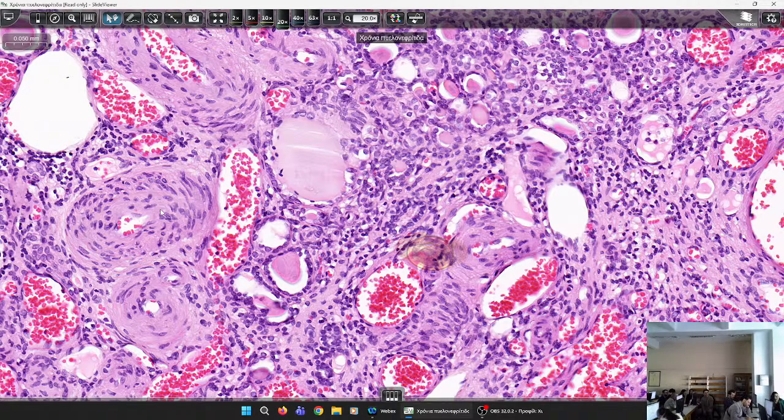And what is the consequence of this? What can this justify? It can justify the atrophy of the urinary tubules. Why? Because the urinary tubules expect what will come out of the glomerulus, the efferent arteriole, to give them blood supply.